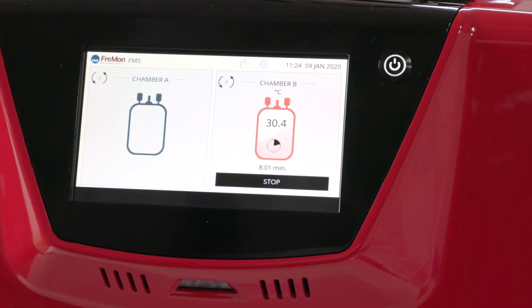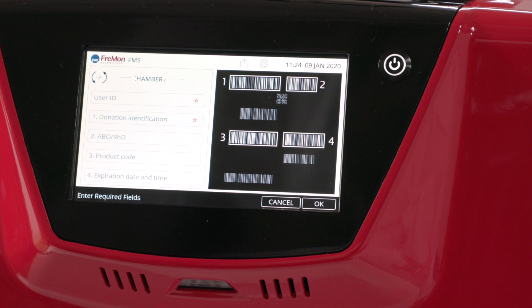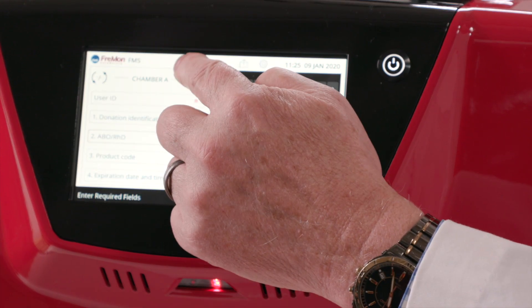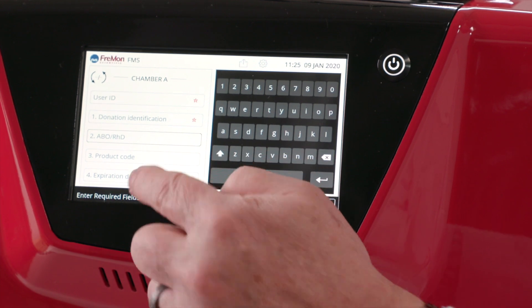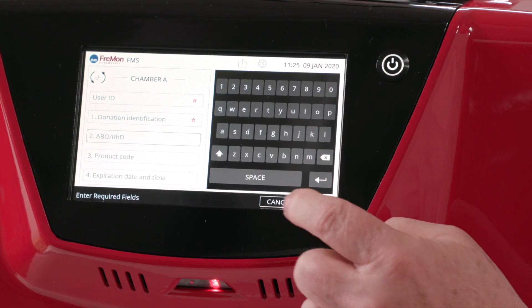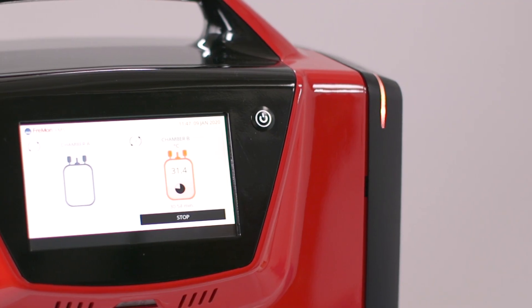Now is a good time to show you the chamber A screen. If you want to add more plasma during a thaw, simply press the chamber A icon and you can start the process of loading a zip sleeve, entering data, and thawing.